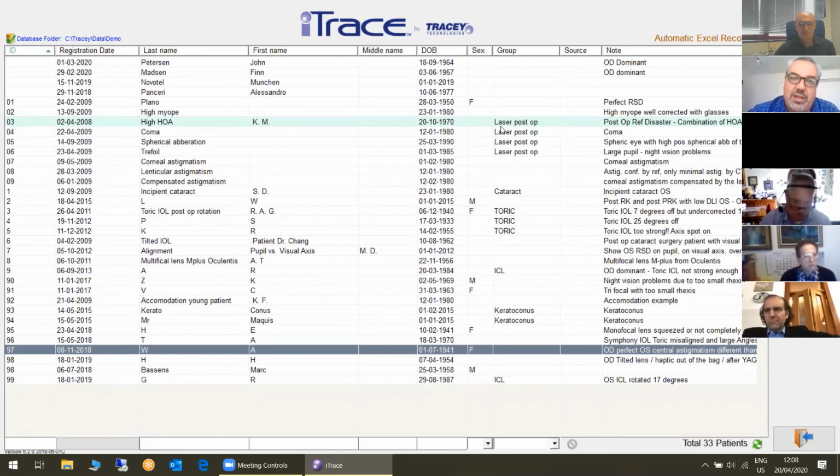Hartmann-Shack is a good technology if you want to measure young patients and you want to link it to your laser, because young patients most of the time do not have problems in the lens. The biggest problem for Hartmann-Shack is it measures the light that comes out.